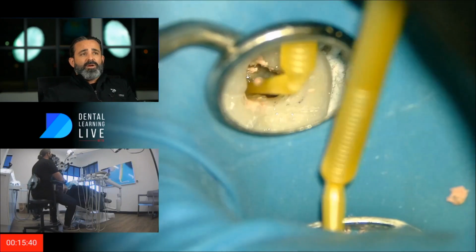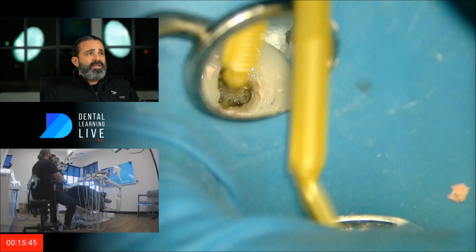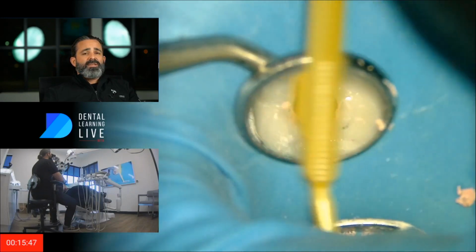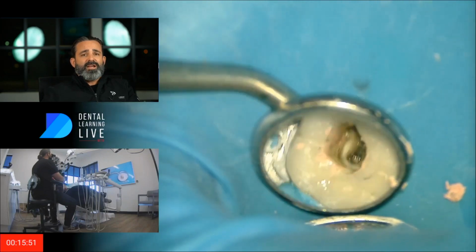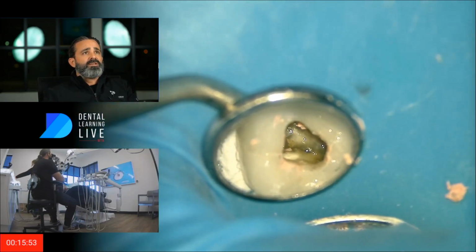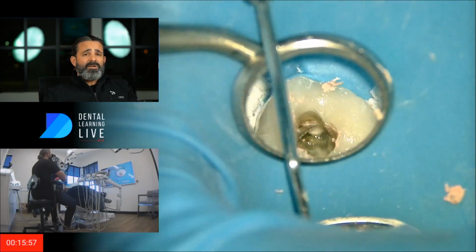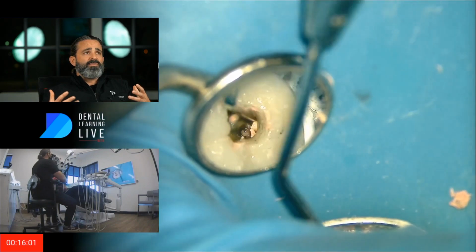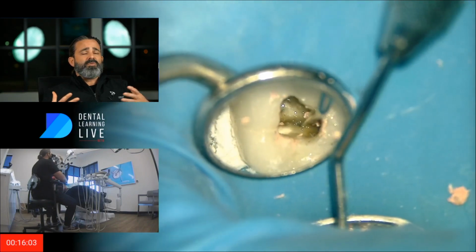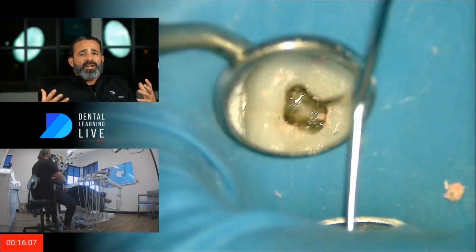And although the GentleWave can dislodge and disrupt a lot of things, certainly organic things, it can dislodge floating gutta percha, but it really is not going to actually remove the gutta percha unless they have a different solvent in there. So for me, the goal of this technique is using the GentleWave, and I want to expose the fluid dynamics to as much of the walls as I can. So I'm really going to try to clean it.